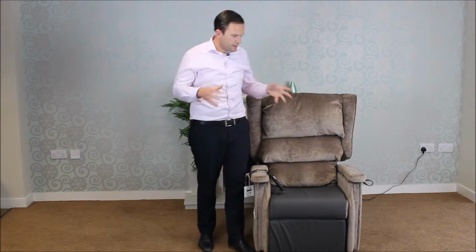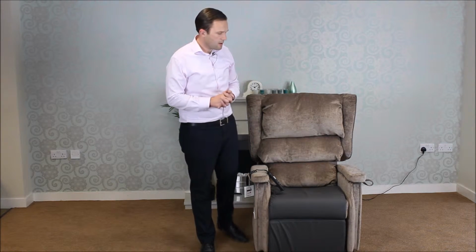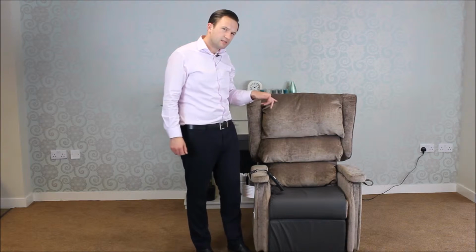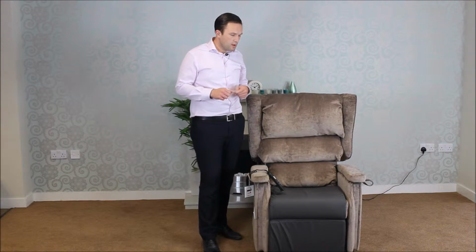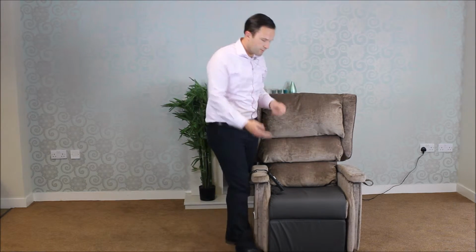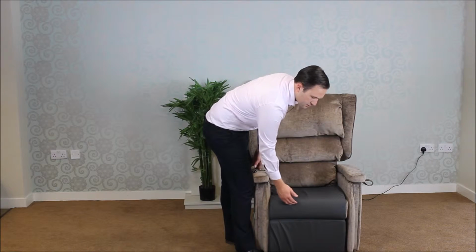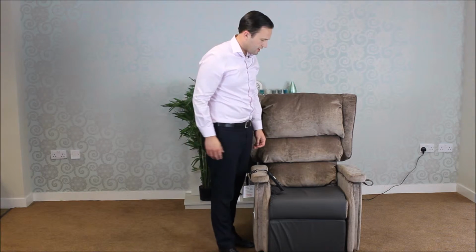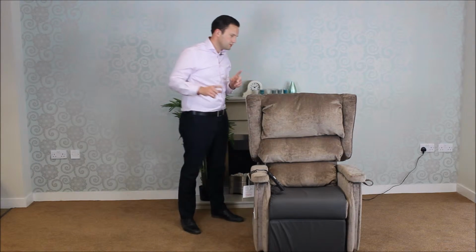So size, is the chair in overall terms the right proportion for the user? Does the user look lost in the chair? Have we, broadly speaking, got the correct size? And then a little bit more specifically, have we got the right seat depth? If it's too great, the user might sacrally sit and therefore be uncomfortable. But if it's too short, you'll find the thighs are not supported well enough, and the legs will then tend to hang off the end of the leg rest. So getting the right depth is important, and if in doubt, I would suggest go generous on the seat depth. We can always reduce it, and here's how.